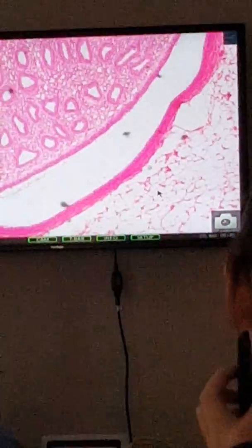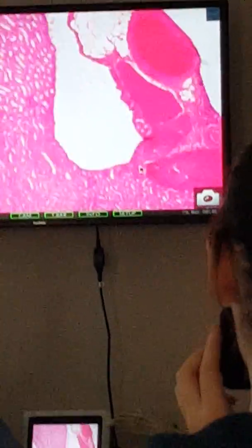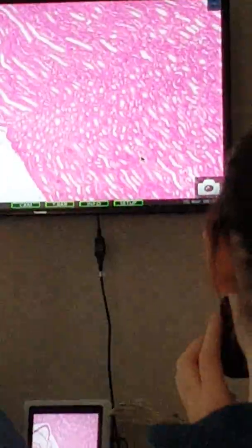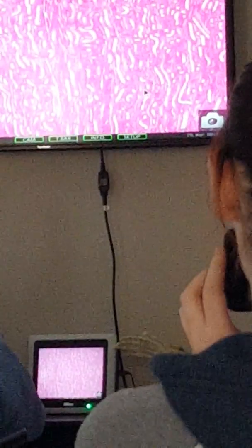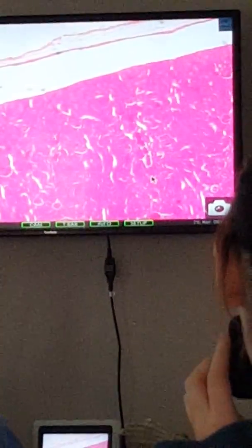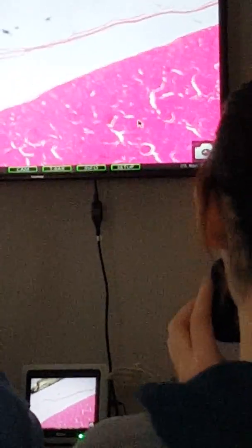All around. Oh, look at that little island of kidney. I go back up here, I'm going toward the base of the pyramid. If I get high enough up, I'm in the cortex again. I know that because I can see all those glomeruli. And look here, the capsule got separated again during tissue preparation. Happens a lot.